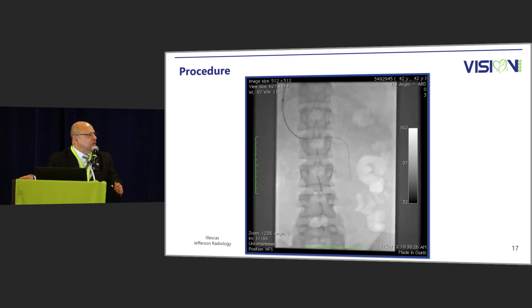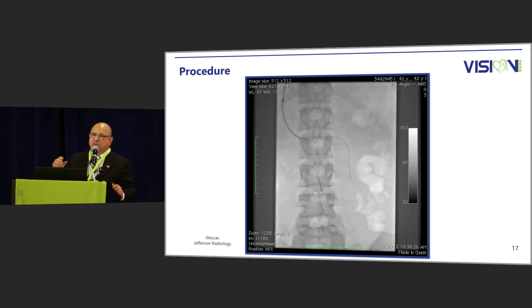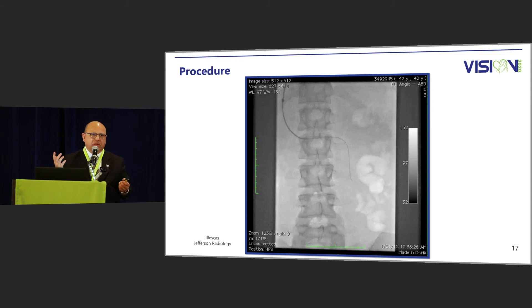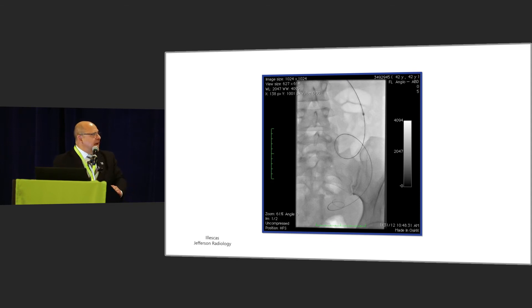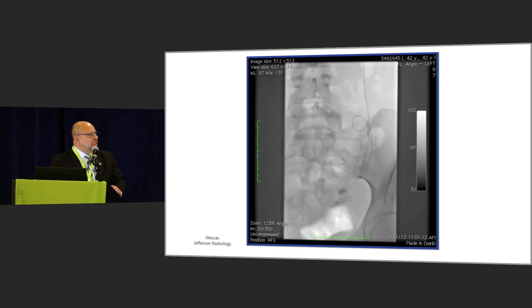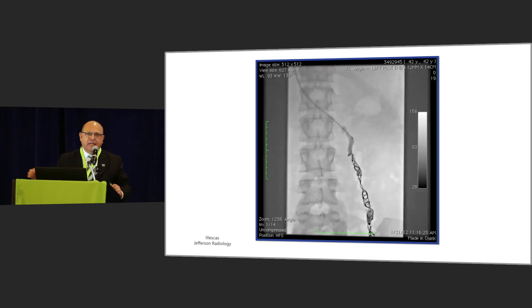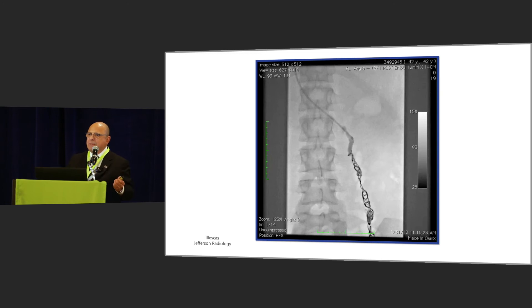We approached this from jugular vein access through a sheath with a glide wire going down. Knowing that hairpin turn from the CTA, I did not advance further — without that imaging I would have wondered if I was extravascular. With guide wire and catheter manipulation I negotiated the hairpin turn, stabilized the catheter, and confidently began embolizing using coils, achieving stasis of flow. Imaging was tremendously helpful in completing this case in a timely fashion.